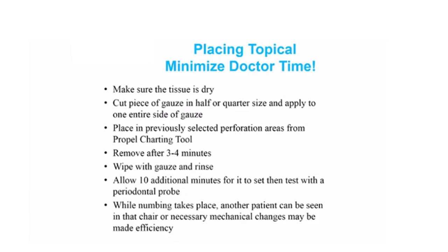We're going to make sure the tissue is dry, cut the gauze to size. The assistants can do this because I've already planned out and charted where they're going to be placing it, so I can still only have one visit to the chair. They're going to remove the gauze after 3 or 4 minutes.